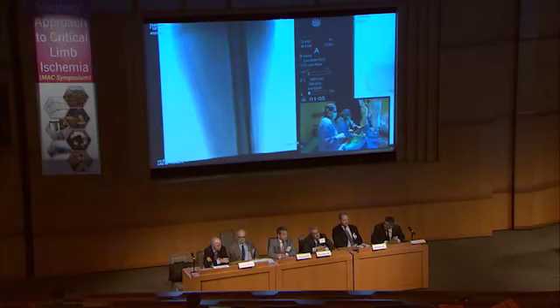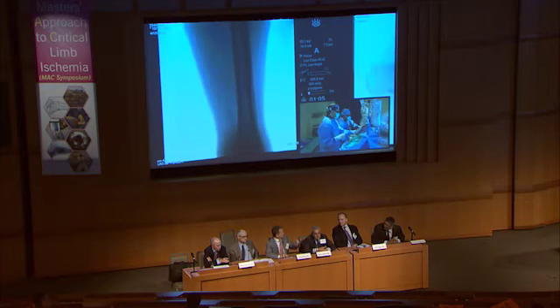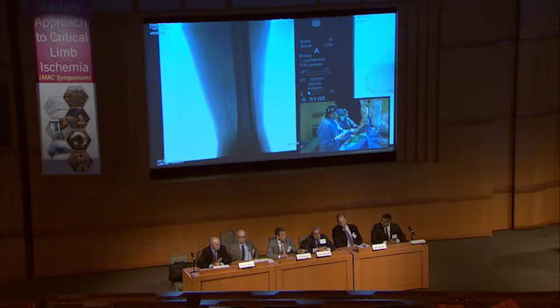That's a great point. You're going to want this contralateral AT for the future as well. So I vote to do it. The challenge is, everywhere you dilate now, it looks worse distal to it because you just dilated and made that segment look a lot better. Using a 3 millimeter balloon all the way down, it looks like this posterior tib distally might handle it, but there's just diffuse disease through this whole thing. So patency here is going to be a real challenge in the long run.